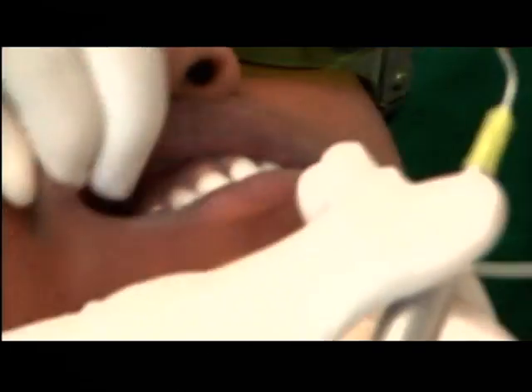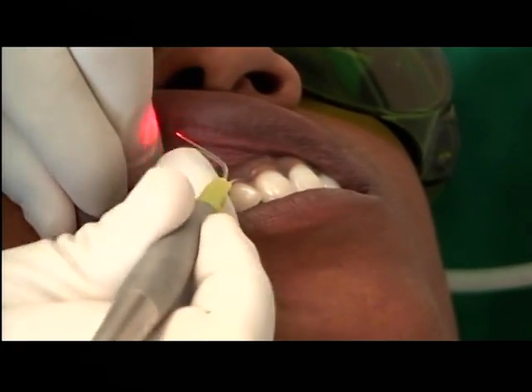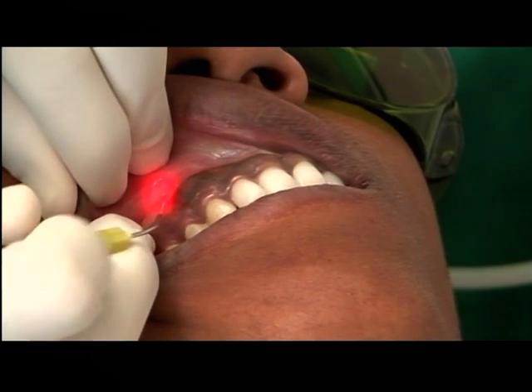We are only using two watts, continuous wave. And now we'll just do a sweeping motion. We'll start from about the measure of four.